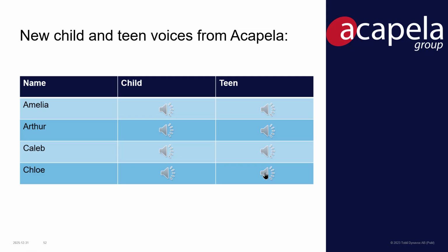So hopefully you can hear the progression from a young child to a teenage voice within Amelia, Arthur, Caleb and Chloe there. I'm really pleased with those voices and that they've come to TD Talk and TD Snap.